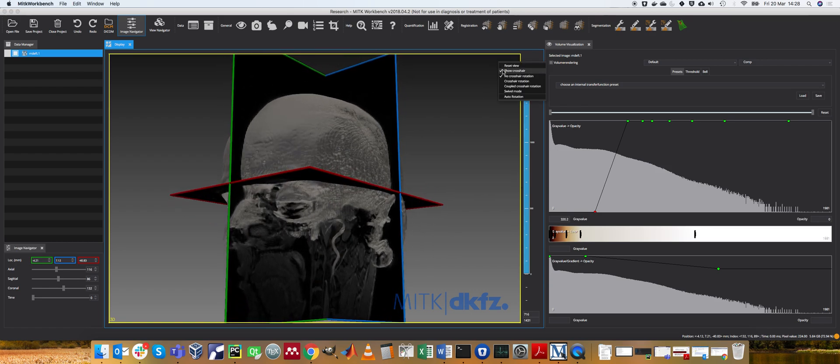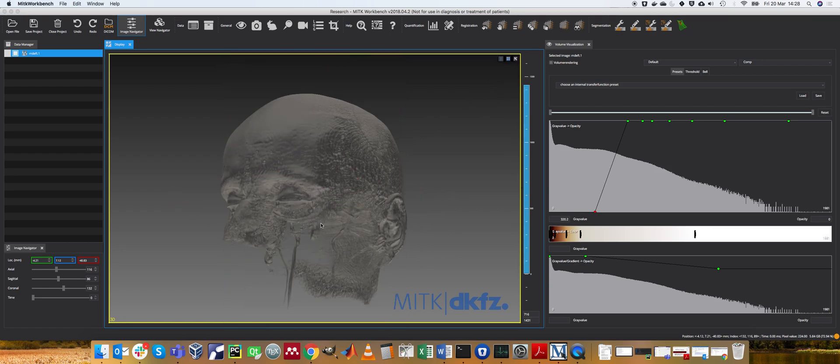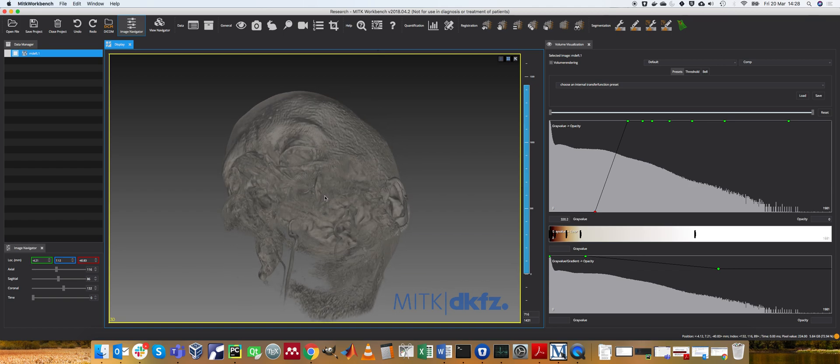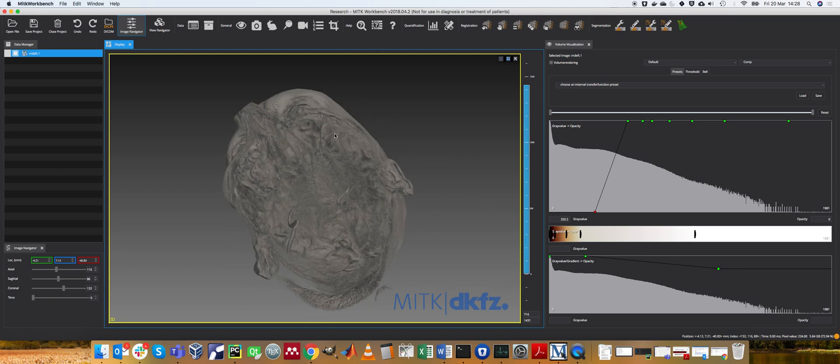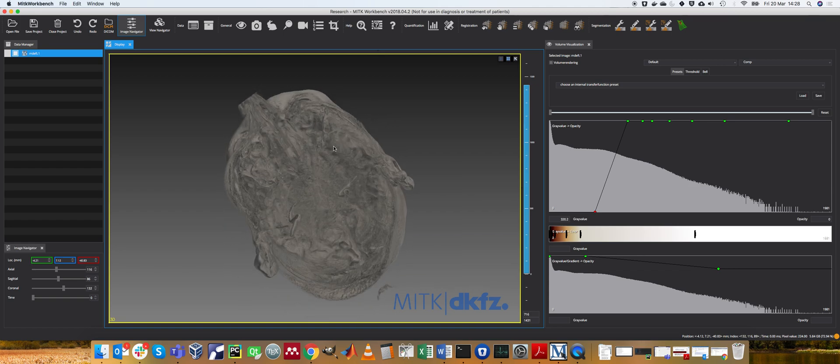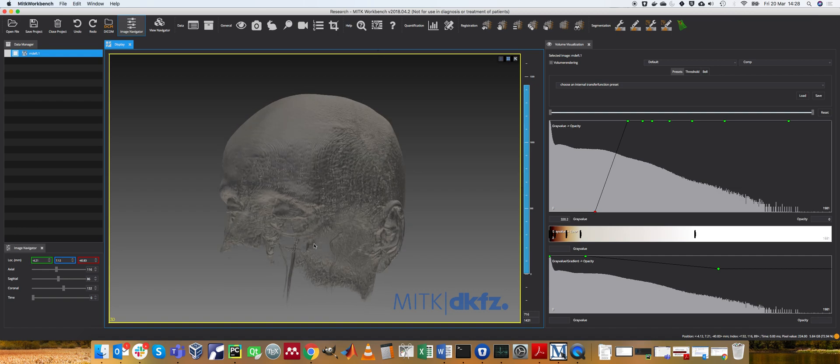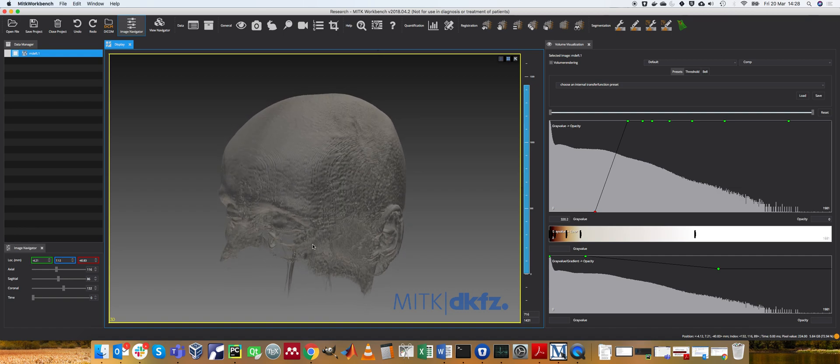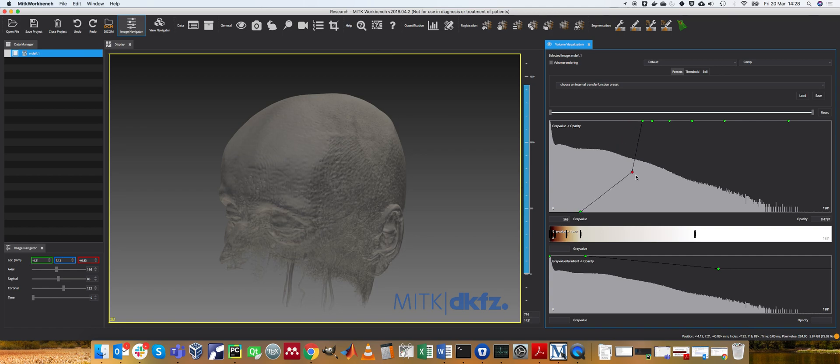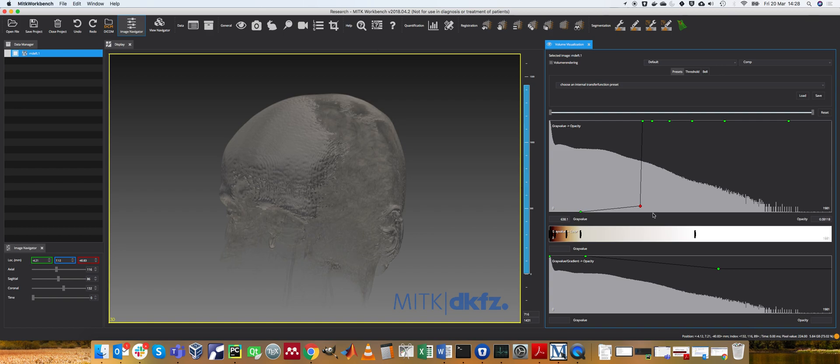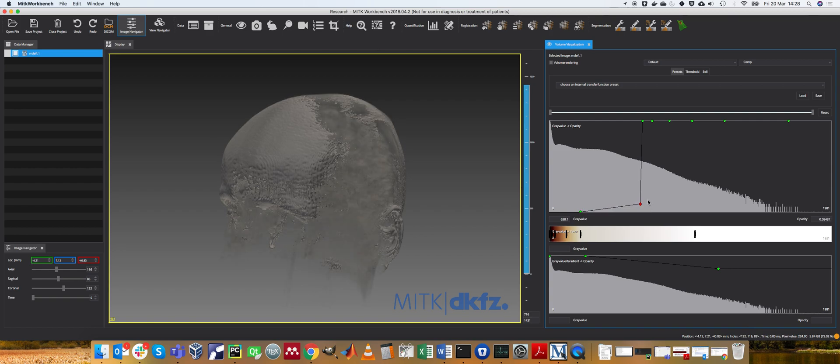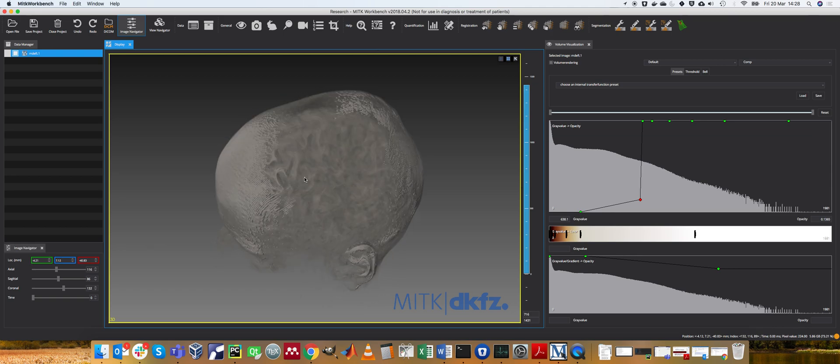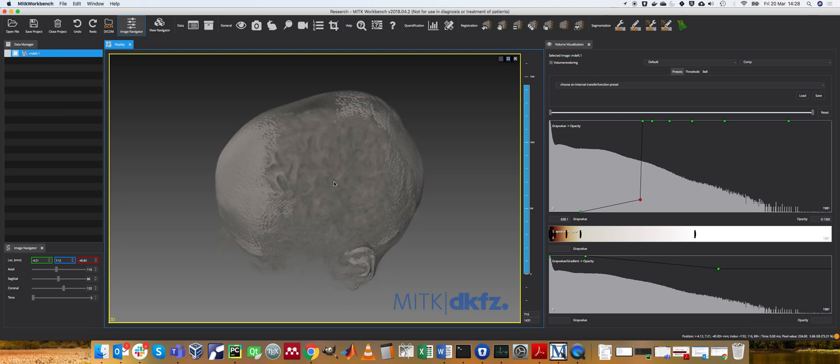If I take these crosshairs off, values below 320 are now transparent, so you can now just kind of look inside. If I move that down slightly and move it to here, you can start to see through my skin here and you can actually see the brain inside.